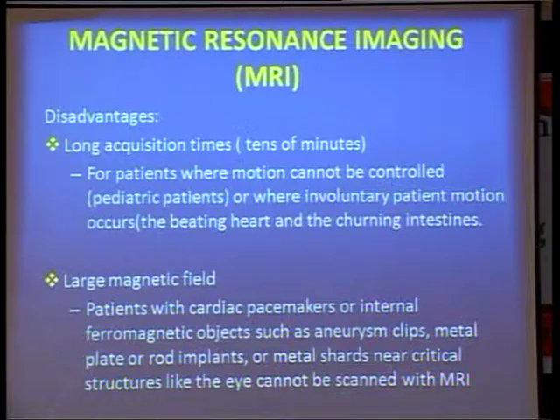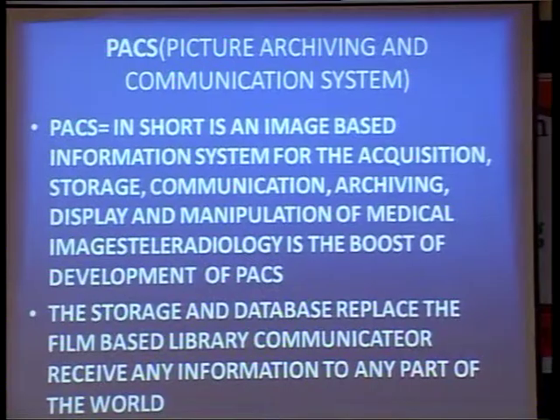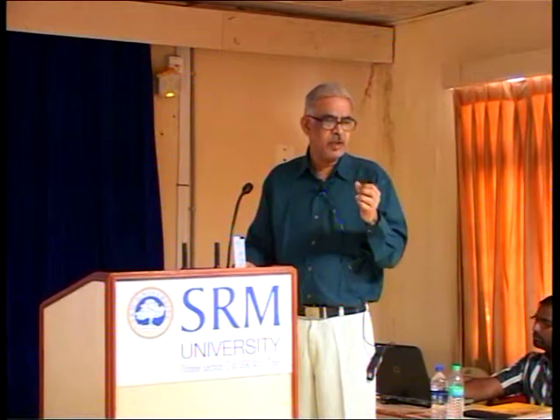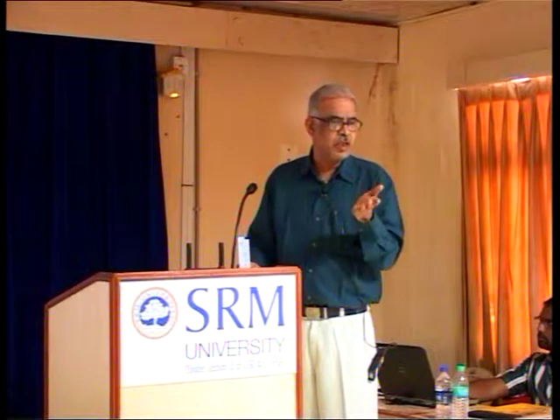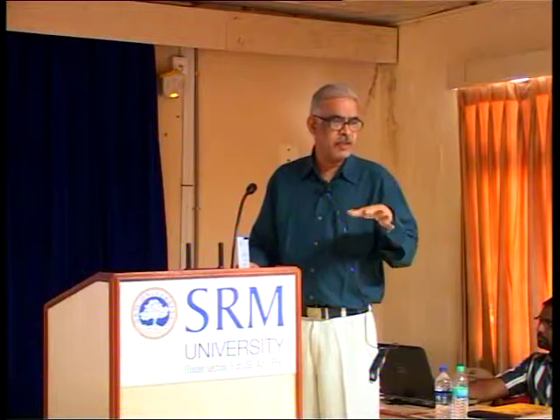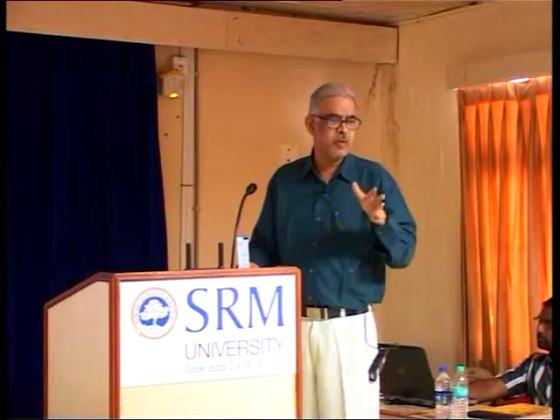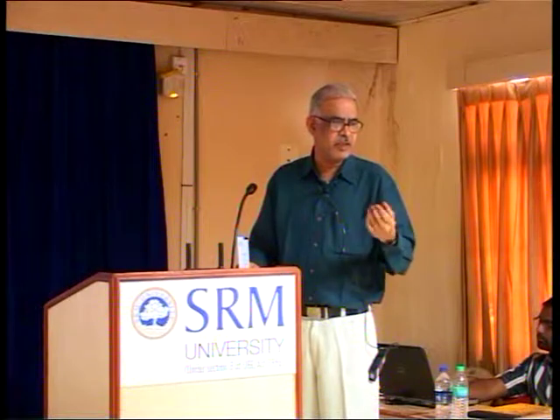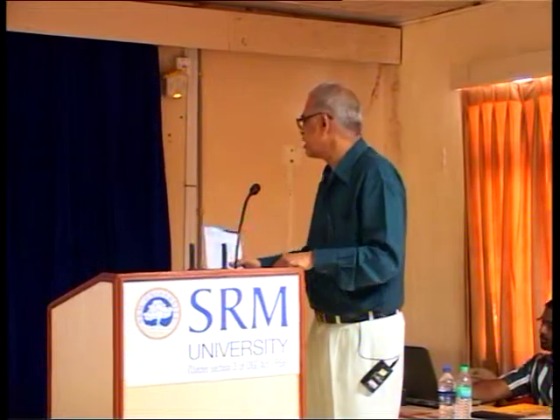Advantages and disadvantages. PACS is the most important one, because whatever images we acquire will be sent to the PACS. It is used not only by the radiologist and other people; the entire hospital information system is also connected. You can see the images from the ward. In our state it was first done in a medical college somewhere around 20 years back. Our hospital got it last year. Now even people in the ward can see whatever happened in the radiology department and see the images.